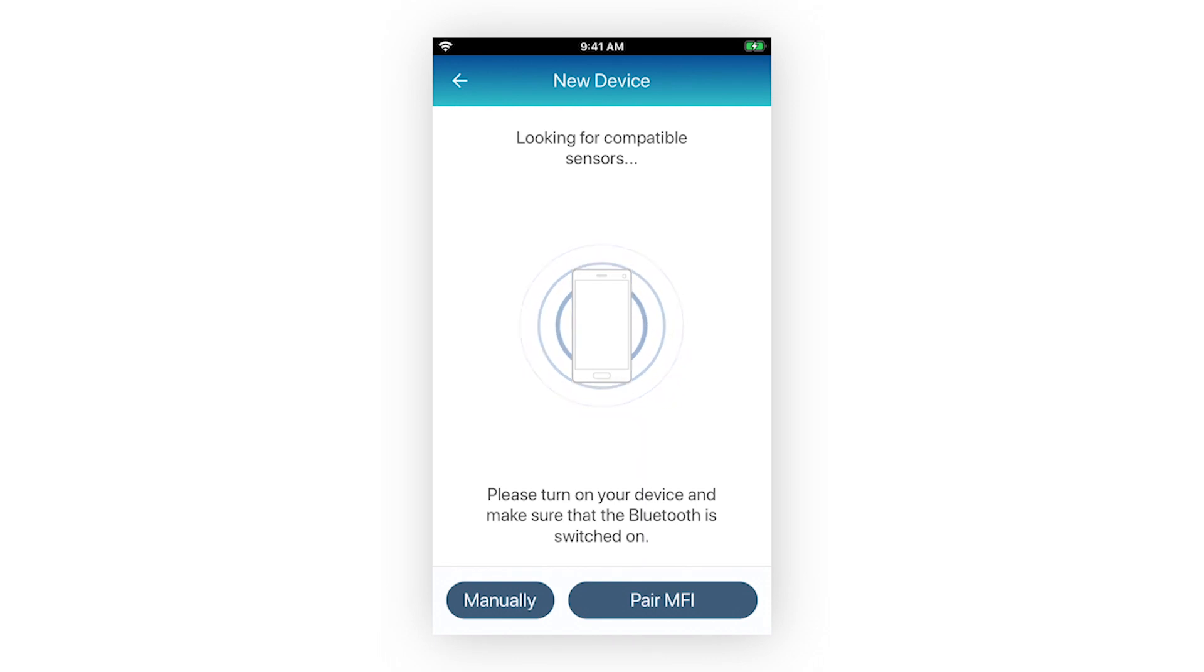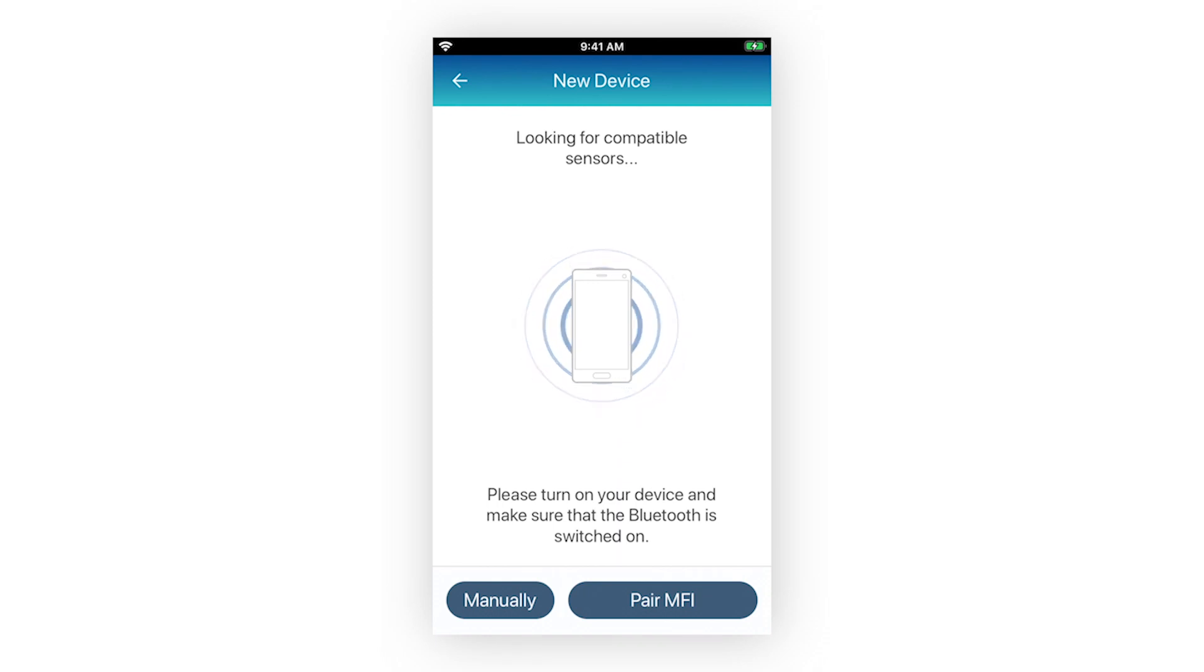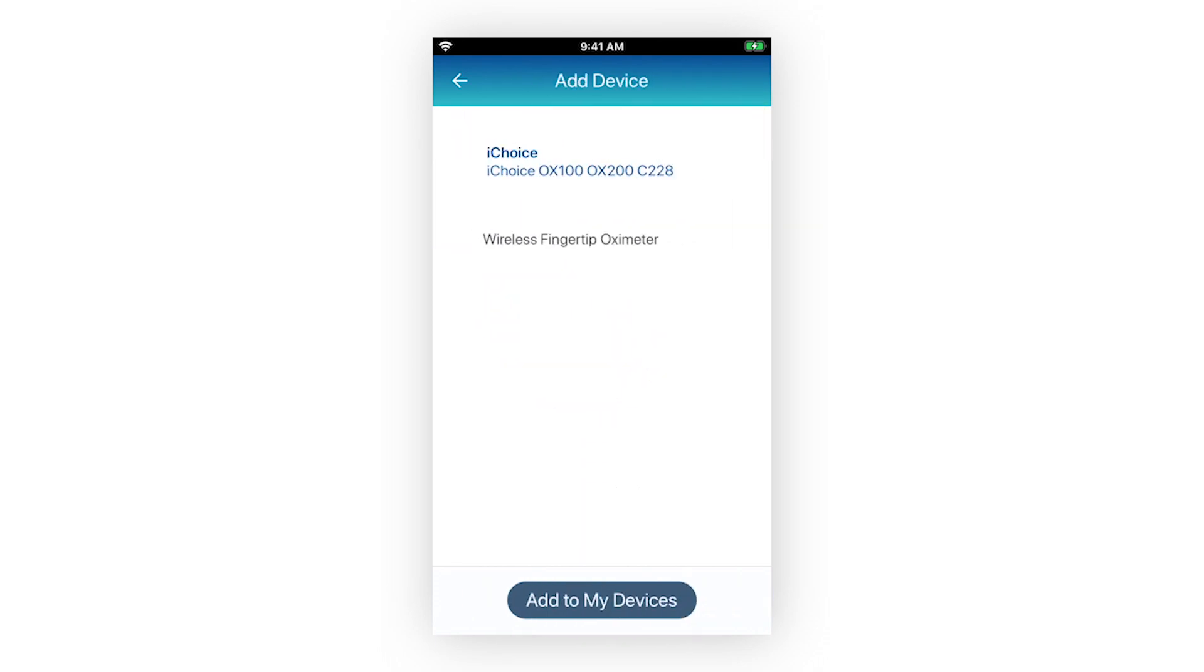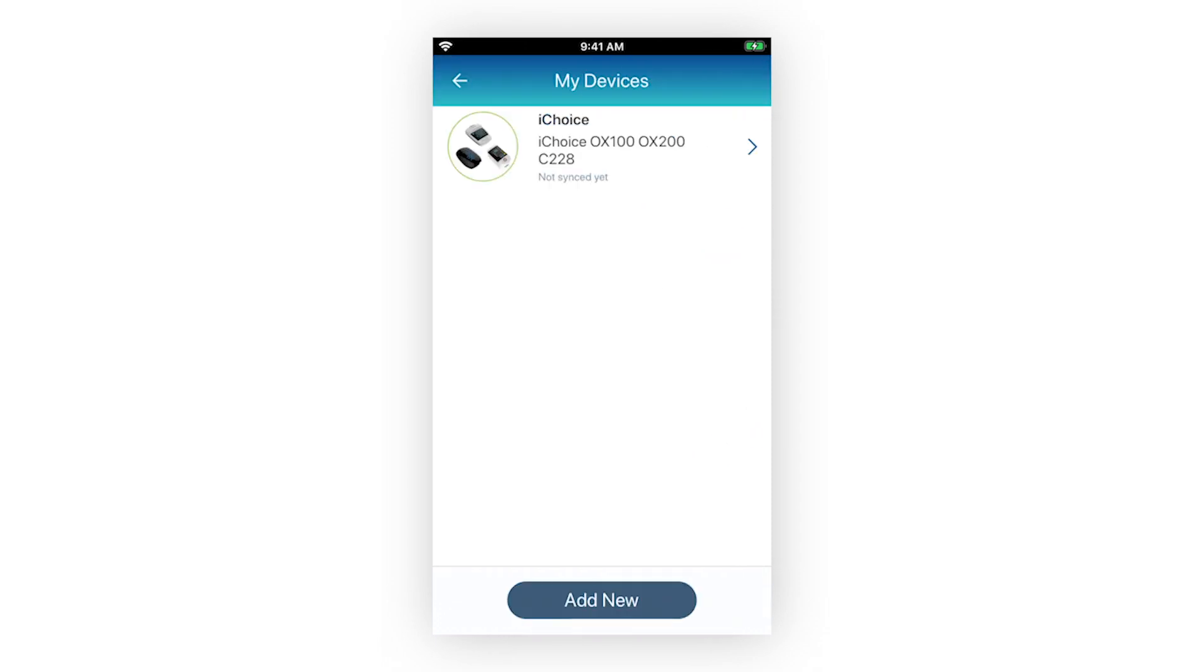Allow a few moments for your smart device to find your Bluetooth medical device. Once found, select the Bluetooth device name in the app. Select the button Add to My Devices. Once paired, you will return to your My Devices screen, where the Bluetooth medical device will be listed.